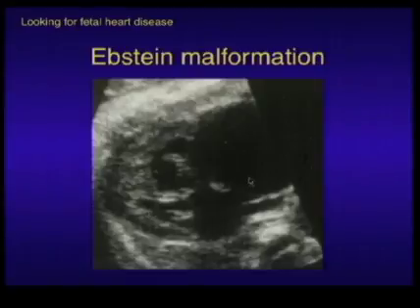And in fact, most of this is made up of a very large right atrium due to a dysplastic tricuspid valve that's allowing a great deal of valve regurgitation. But the main thing to think about here as the frontline person doing the scan is when we look at the whole chest here, it's almost all heart. There's only a little bit of lung, and something's wrong with the heart to make it this big.